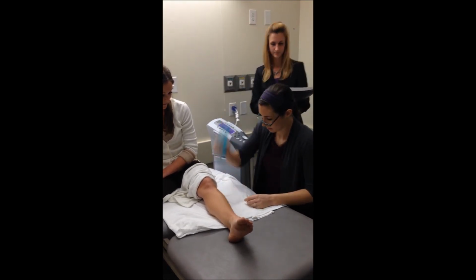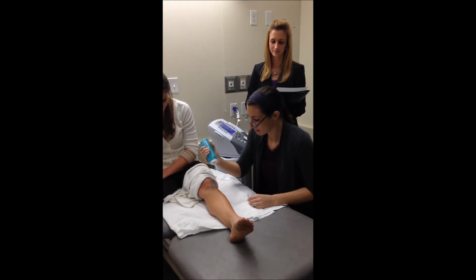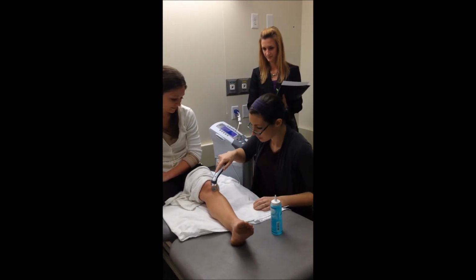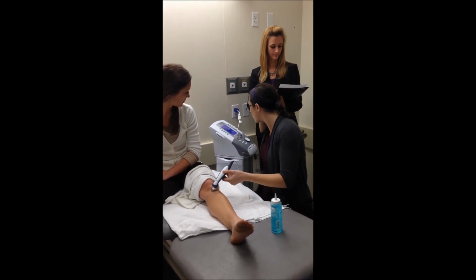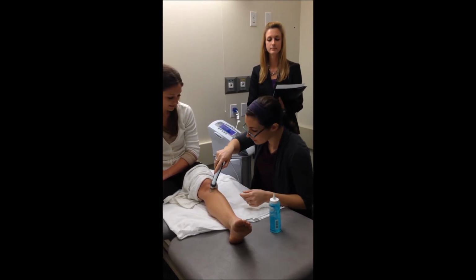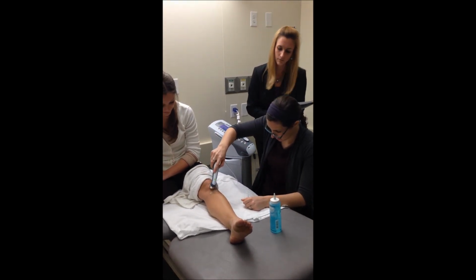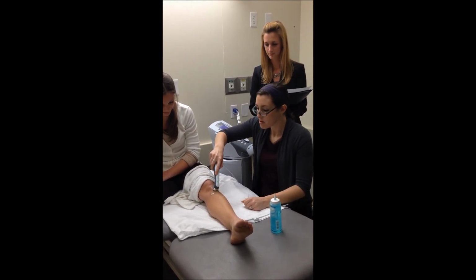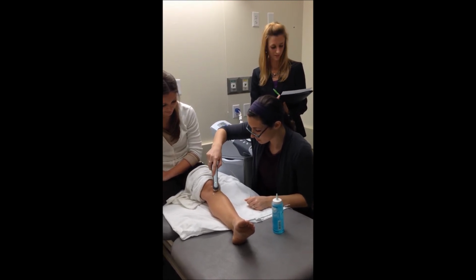Okay. Make sure it's good and gelled. Nice work. And I'm going to take this here and put it on there. And where's start? Here. Oh, the green light turned on. I think that means it's good to go. And I'm going to make sure there's lots of gel underneath this head. And I'm just going to keep moving it around in little baby circles.